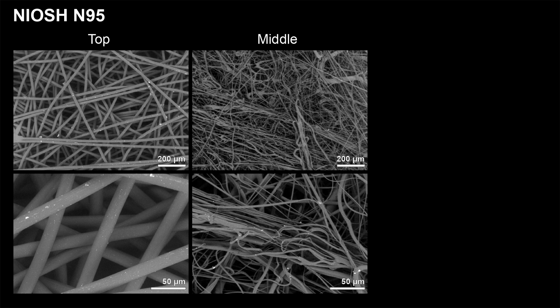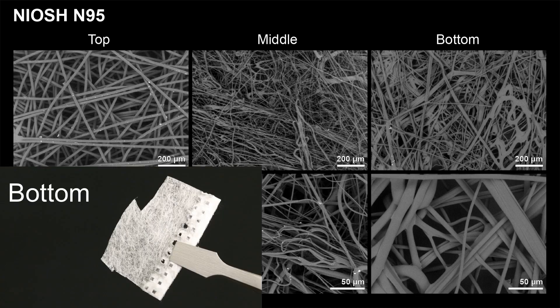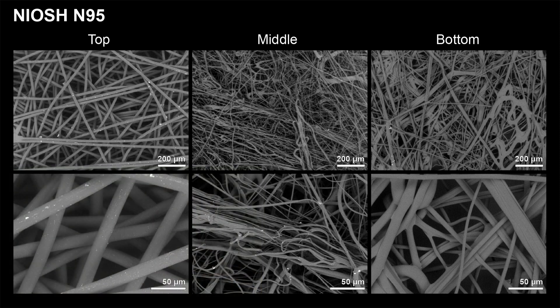This structure allows N95 respirators to be much more effective in catching small nanoparticles such as the coronavirus. Furthermore, this layer is also electrostatically charged, which allows it to attract and trap oppositely charged particles. The bottom layer of the N95 is also quite different from level 1 and level 3 masks — it is made of a combination of thin and thick fibers packed together, and it is expected that this layer will also aid in filtering out small particles.